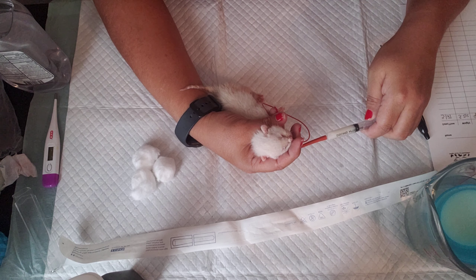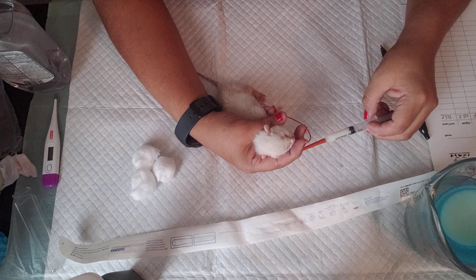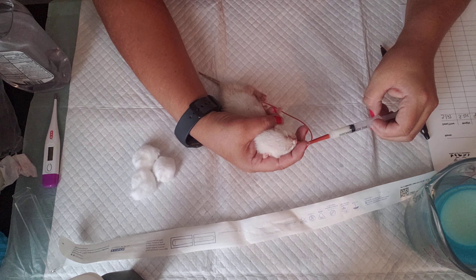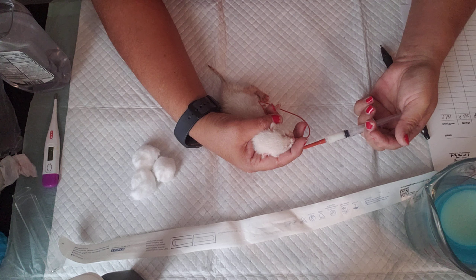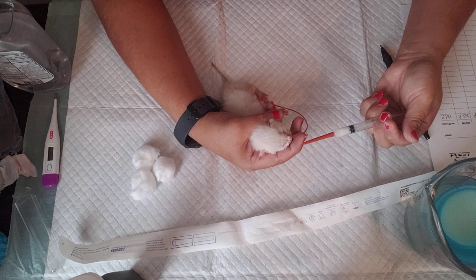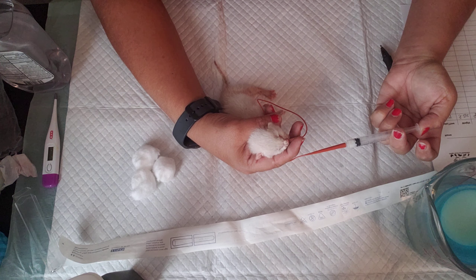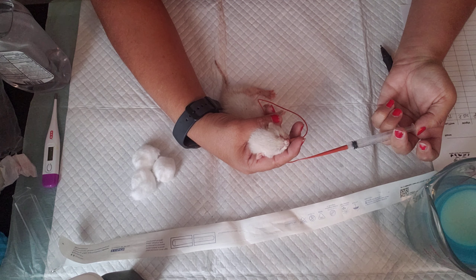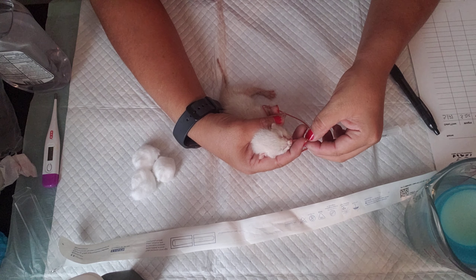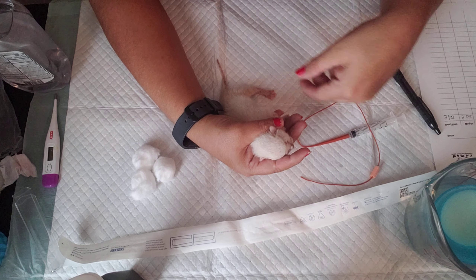So I'm going to go ahead and finish this one. Just don't go too fast — just slow and steady. If it wasn't in the right place, most of the time it wouldn't even go down the tube. But you always know if it's in their airways by bubbles or milk coming out. I pinched the tube, and there we go.